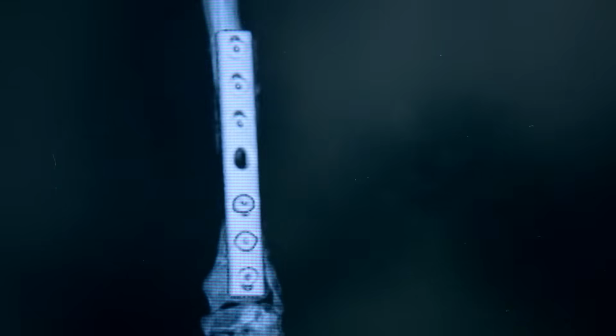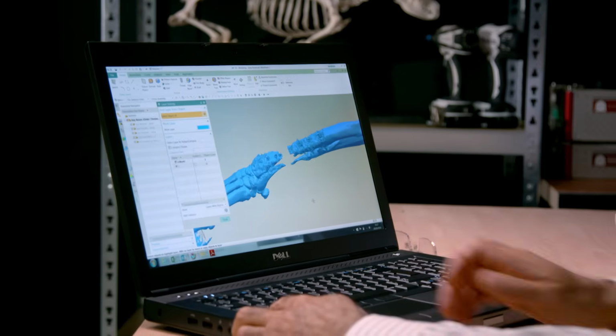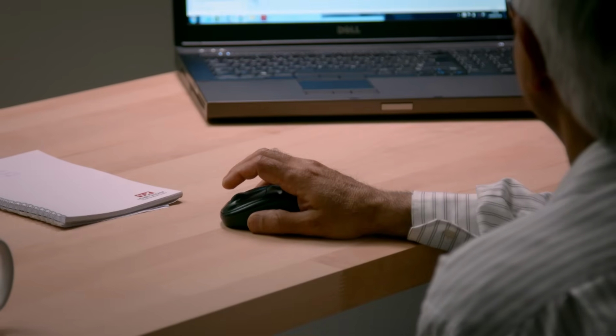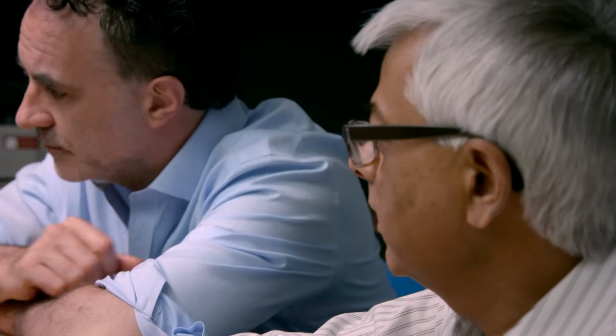So concerns will be mechanical failure, failure to incorporate, infection, implant breakage. Lots of possible problems. I haven't seen the pictures. The challenge they face is the sheer size of the gap and that a leg is subject to high stress levels through movement. So I guess that leaves us with bridging options of a solid chunk of metal or a trabecular metal. Okay. I have created a spacer which is about that length. Cool.